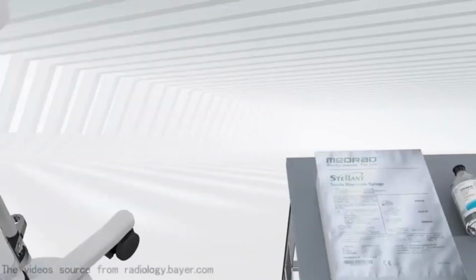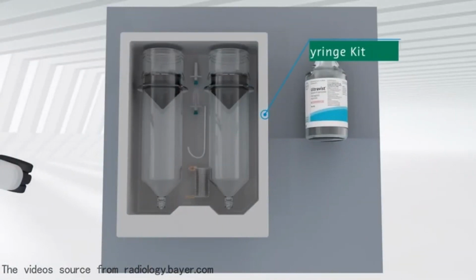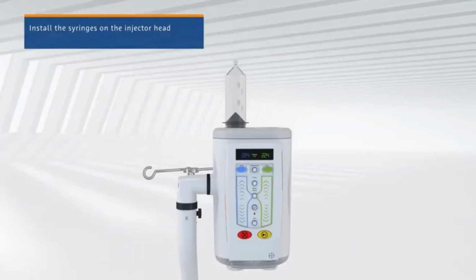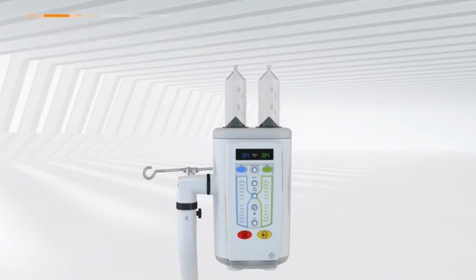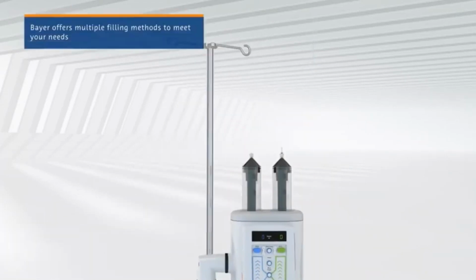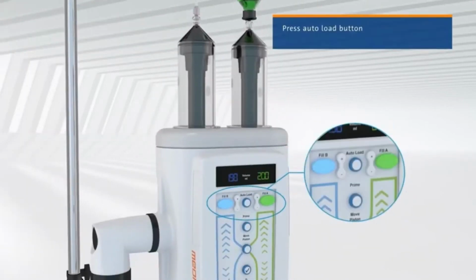Automated contrast injectors were first introduced in the cath lab as a way to conserve contrast media in an effort to save money, Newton said. However, using less contrast has now become an important patient safety issue. There is increasing concern over patient contrast dosage during procedures, particularly in patients with renal impairment. The iodine-based imaging agents used in angiography and CT can cause contrast-induced nephropathy, CIN.